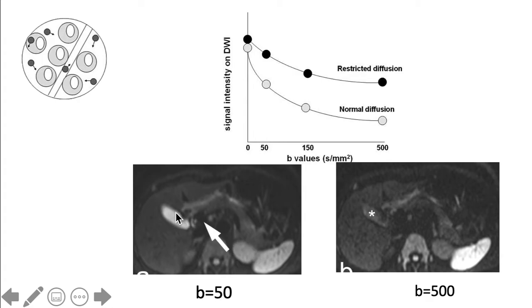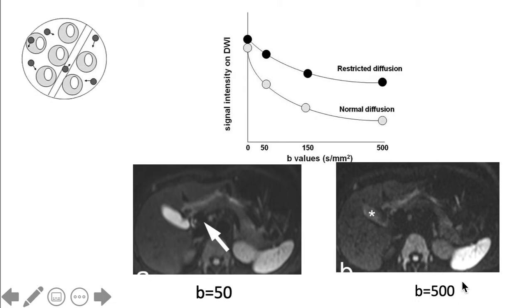We also notice here that the water within the bile is bright because of its slow flow. If we compare it with a higher B value, there is a relative signal loss in the slow-moving bile. Therefore, we say that higher B values are sensitive to both fast and slow-moving water.